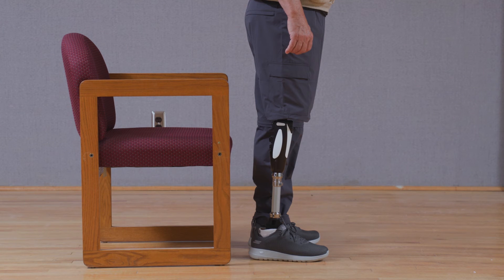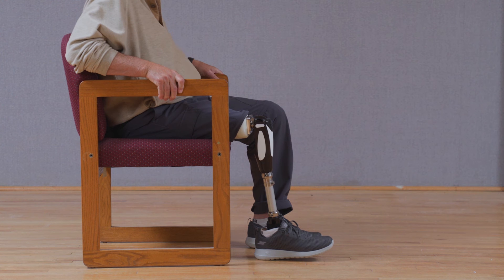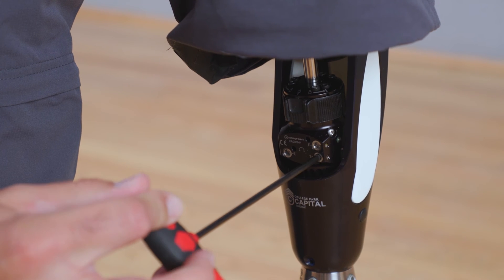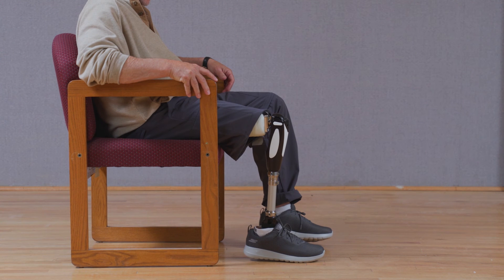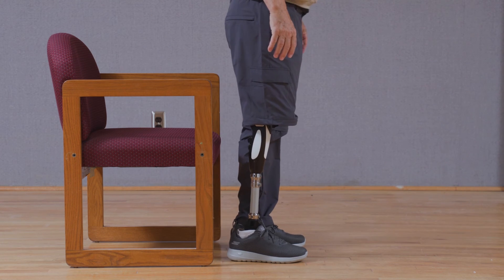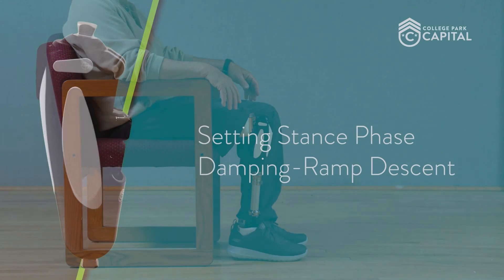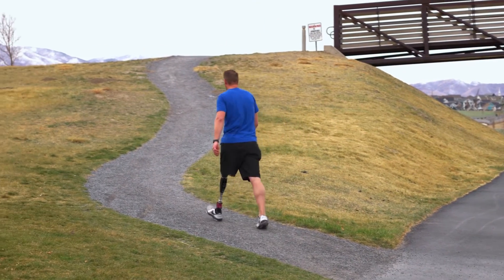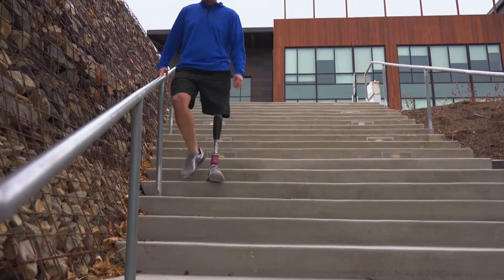To set the optimal stance phase damping for the unilateral user, have them stand in front of a chair and sit down using both the sound side limb and the prosthetic side limb. If the stance resistance is set too high, the knee will resist the user too much when attempting to sit. If the resistance is set too low, the user may drop into the chair in an unsafe manner. When optimized, the knee should provide appropriate resistance to allow for a safe and controlled movement from stand to sit. After stand-to-sit function is evaluated, the user should evaluate resistance during ramp descent and stair descent, ensuring it is not too fast or slow but optimized for the user's needs.